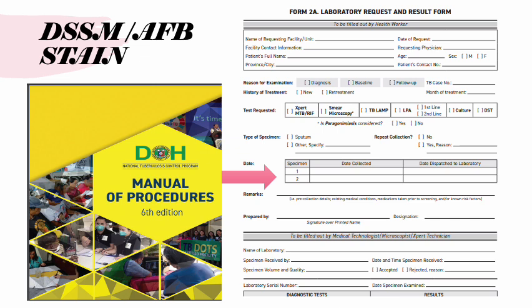This is checked thoroughly by the medical technologist on duty for it to be completed and the information of the patient reported. The information should be complete, the demographics and others, because this is reported completely to the DOH.